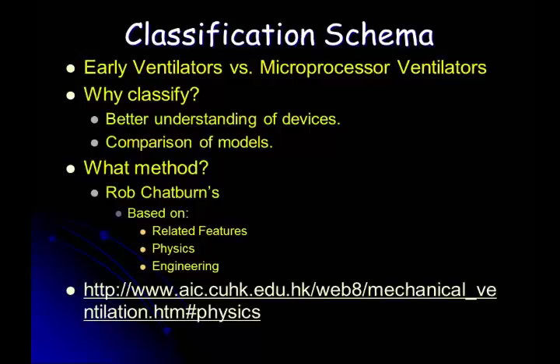It's all based upon compliance and resistance and flow pattern. And what the mode did was change the flow pattern. Well, yeah, of course you're going to get a lower pressure. Don't be stupid and think that the ventilator's got this magic thing inside of it that'll be able to do it.